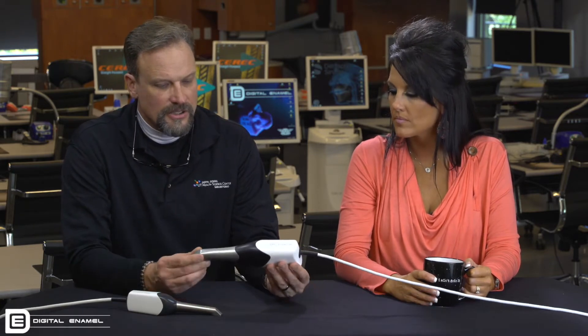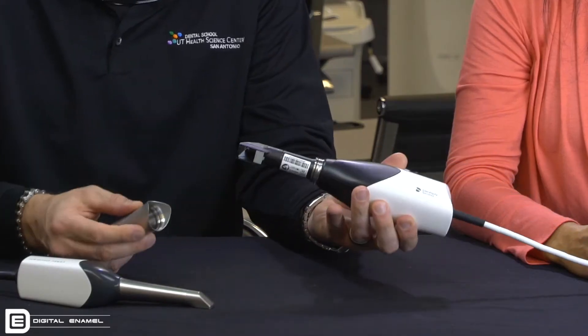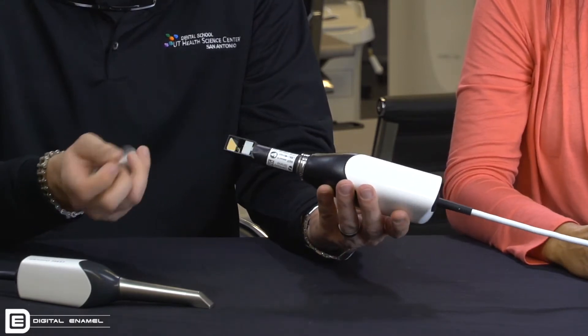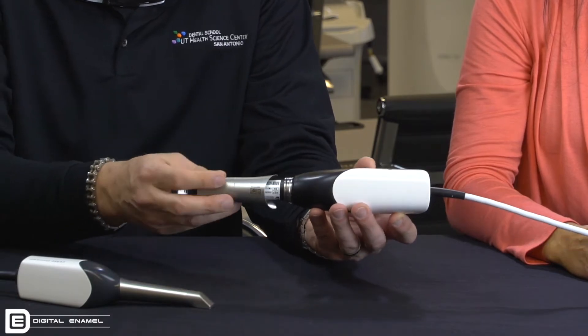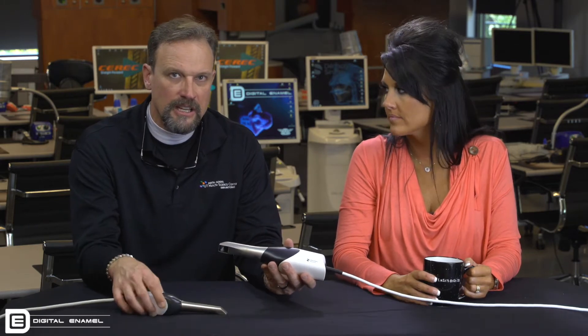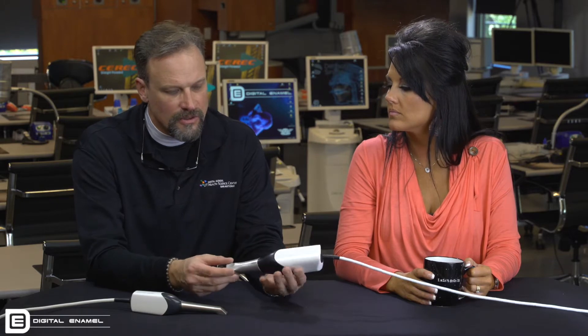The way the PrimeScan actually works — first of all, it has a tip that can be taken off, so there are multiple different tips for sterilization purposes. Everything is contained within the camera. There's also a disposable tip. The heating element is within the camera itself, whereas with the Omnicam the heating element is on the computer — it keeps the glass warm so it won't fog.